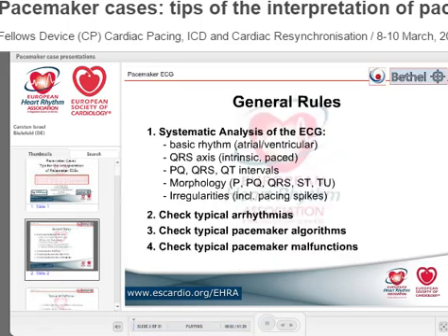So if there's one thing I would love, it is that after this course, when you go home and do your clinical practice in everyday life, you will never ever make an ECG interpretation of "pacemaker ECG, 60 beats per minute, full stop." That is what I see sometimes, and it is like you do a coronary angiography and you say, we detected 3 vessels, stop.